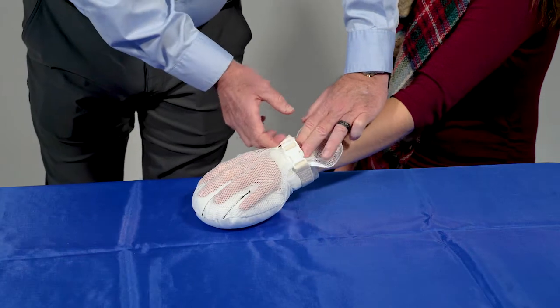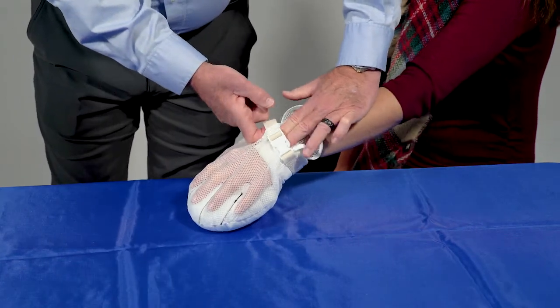Insert two fingers flat underneath the buckle and adjust the buckle strap so the mitt fits properly.